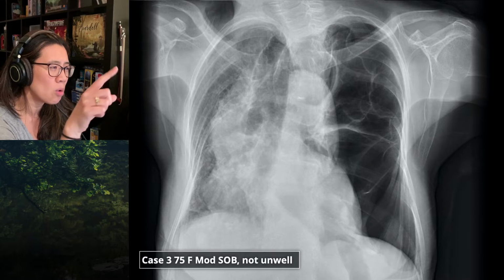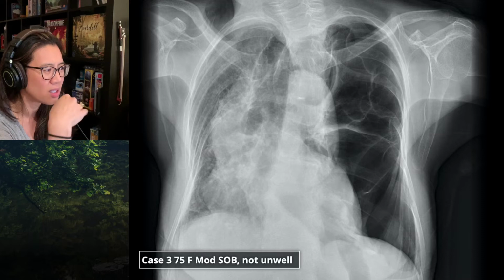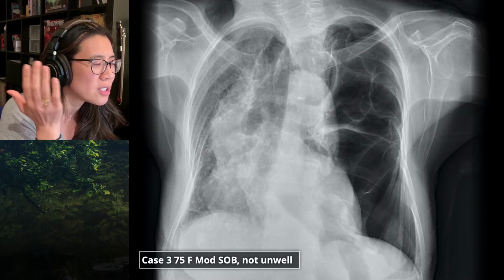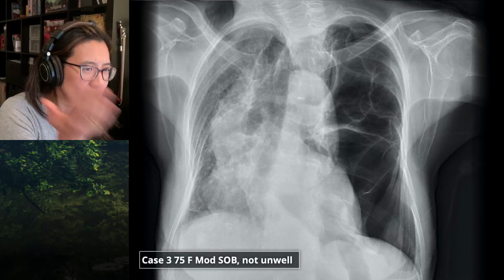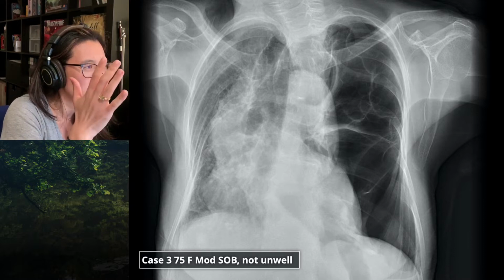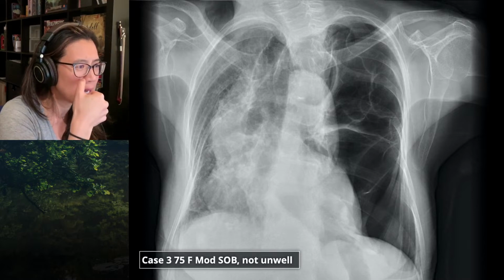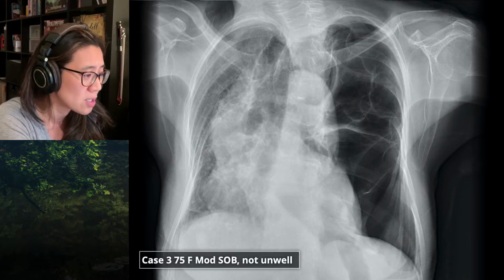I'm not sure whether that's a more loculated component or whether it's just one of those bands which has remained in situ. I'm not sure where the pleural edge is. So my main differential that I'm trying to exclude here is a tension pneumothorax. But she's not unwell, and I don't see a classic pleural margin to show that there's a large pneumothorax. The other differential would be really bad bullous disease, which I've seen, which can mimic a pneumothorax. So I think the key thing here is knowing what her previous chest X-ray looked like.